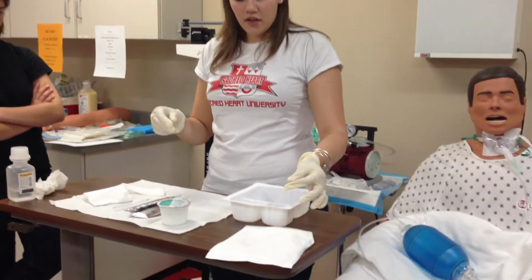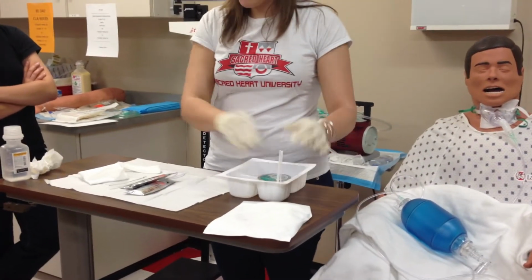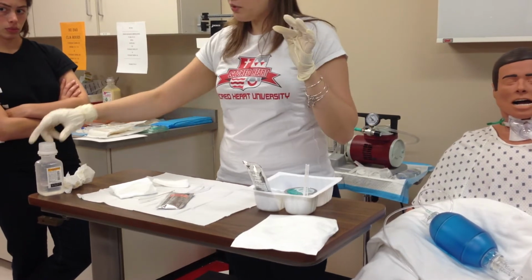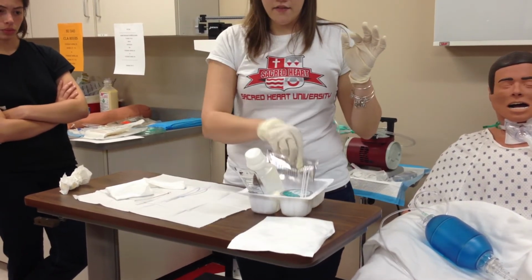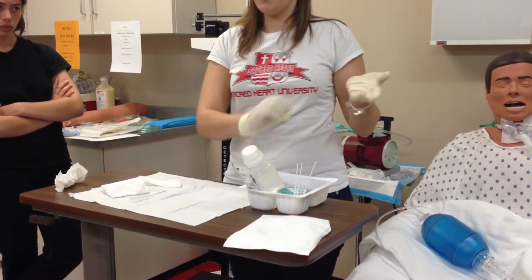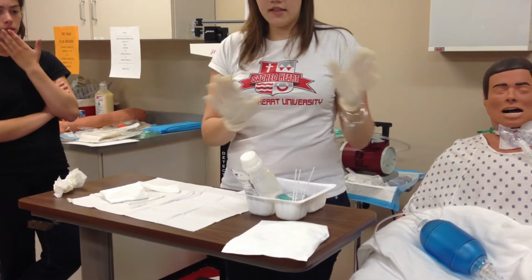these 3 Q-tips are going to go in one of the small basins because that's where you're going to put the saline. Then you're going to have another one of the small basins that has half hydrogen peroxide, half saline, and then the big basin is going to have all hydrogen peroxide. Again, they're not going to be watching to see which one you really pour it in, so if you can't remember exactly what goes in what, it's not a big deal.